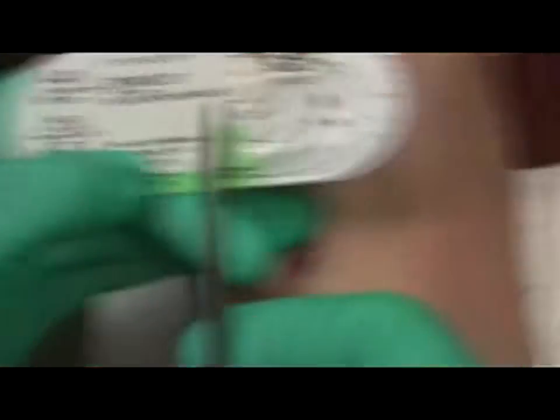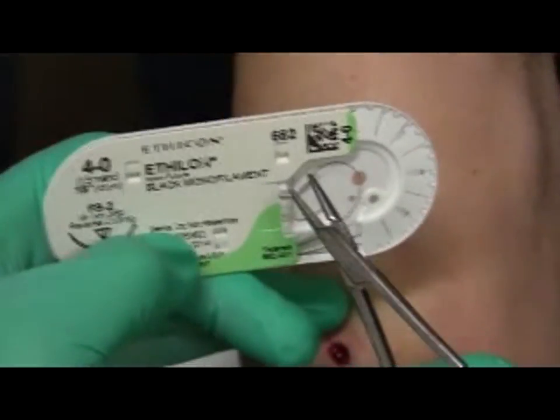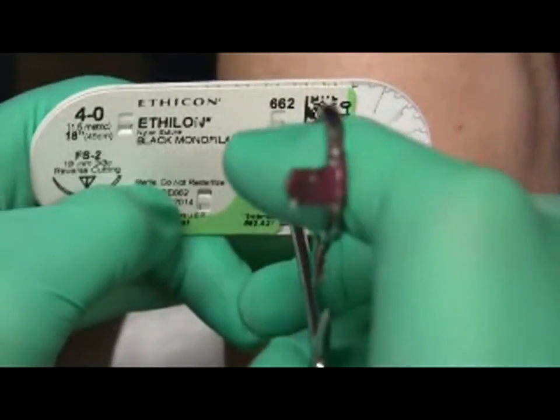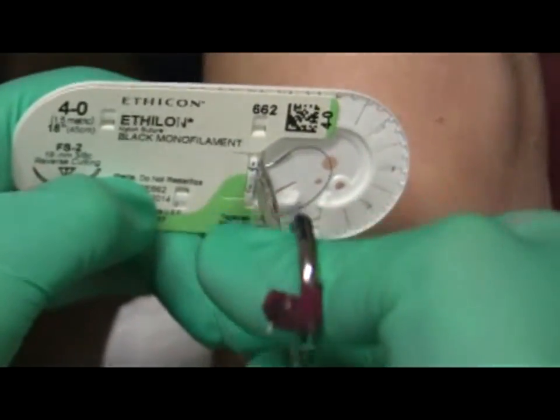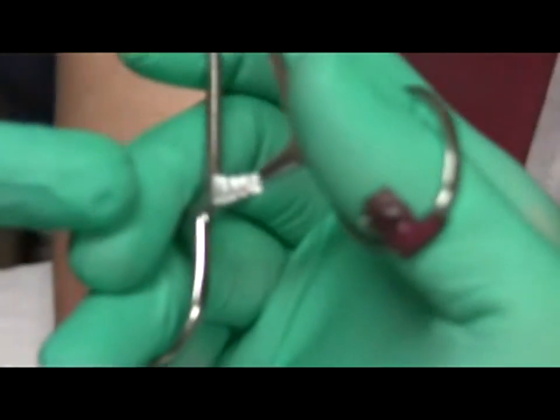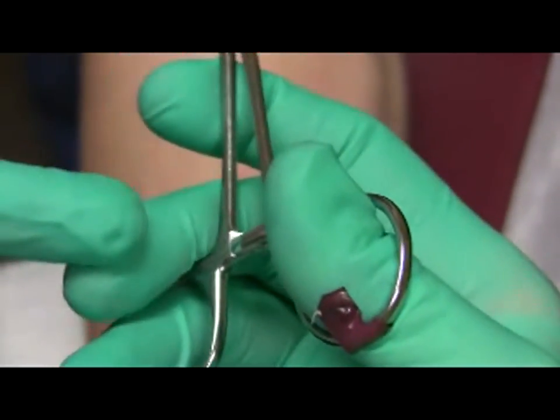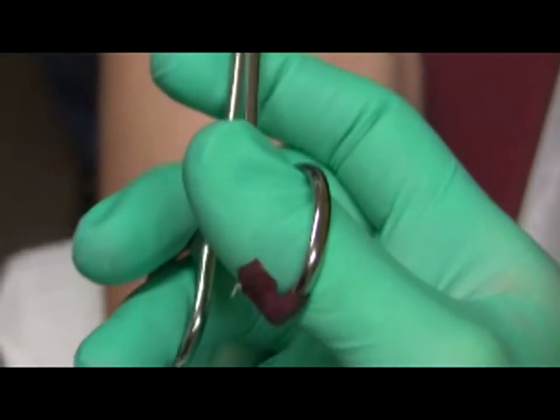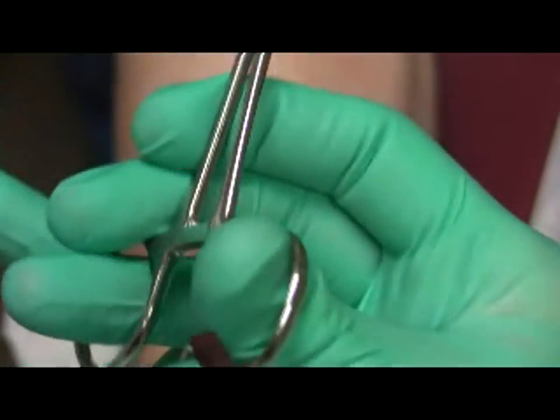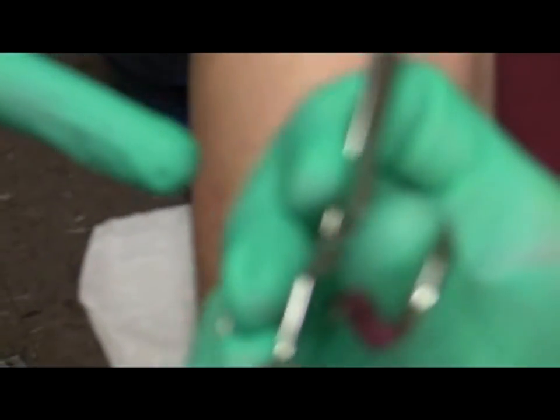The way you grab the needle — this is already set perfectly in position. I open the needle holder, the needle driver, I put this on and click it into position. Now you'll notice the needle driver has notches or teeth here, and they click into place. To open it, I put pressure this way and pressure that way, so it unlocks. You see I'm putting the pressure there and it opens.